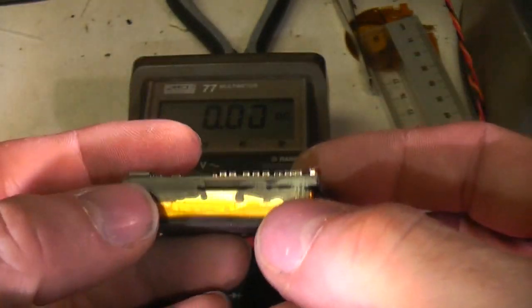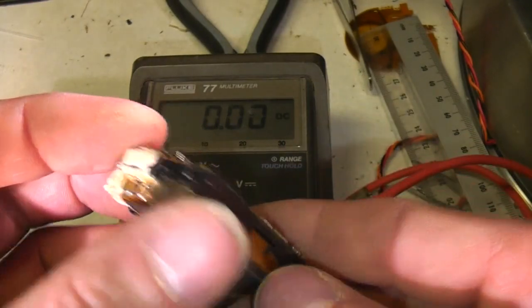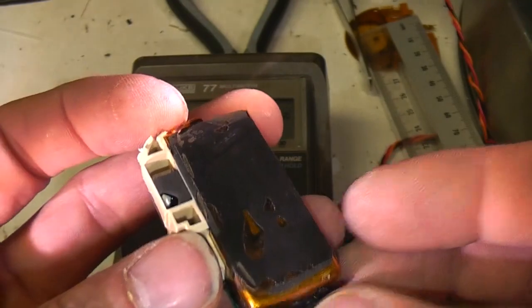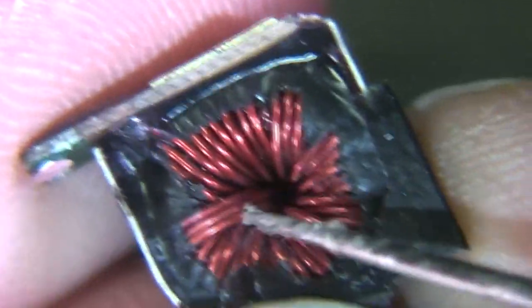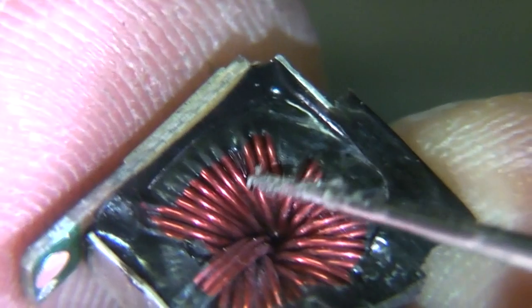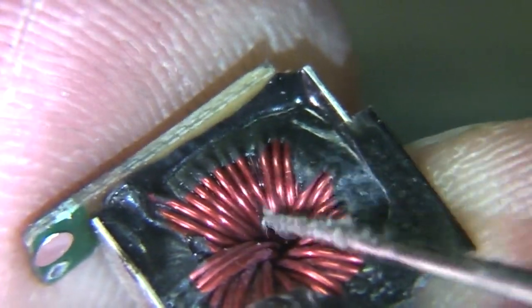Now there seems to be quite a lot of this black potting compound around here, so it might be a bit tricky to get any further into this, but we'll have a go. And yes, this does look like the high voltage transformer. We've got a toroidal core with some chunky windings there, and you can just see some finer windings underneath it.